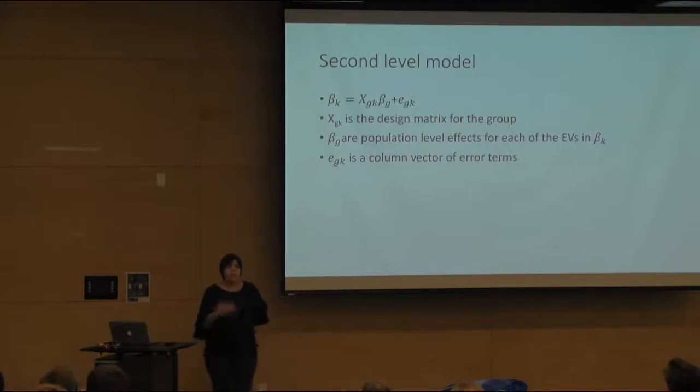If every time you got a new subject you had to rerun your group analyses and the single subject analyses, that would take quite a lot of time, because I think people have noticed that running the single subject analyses takes quite a bit of time. So it's more efficient to do each subject separately and then group those.